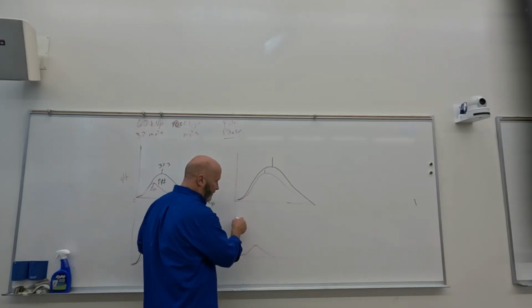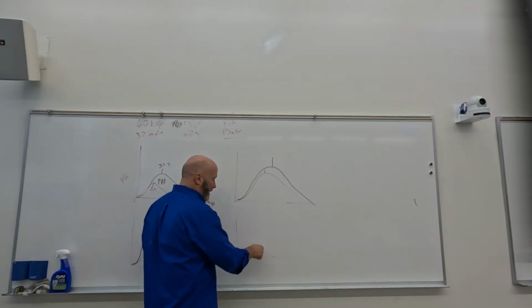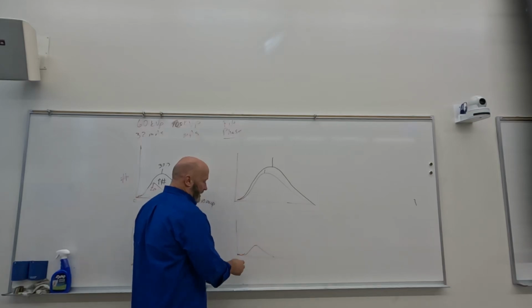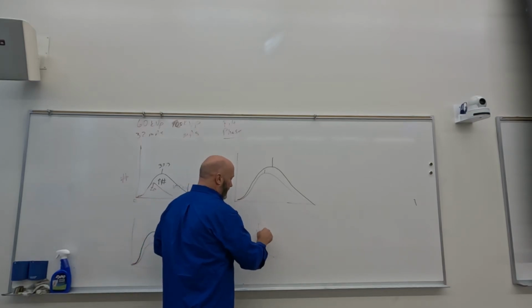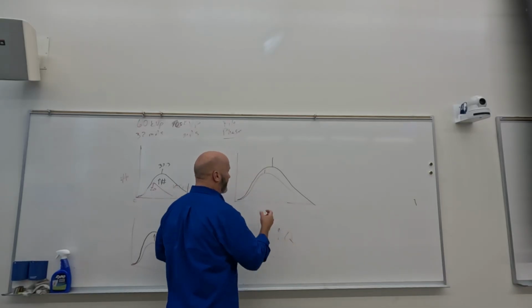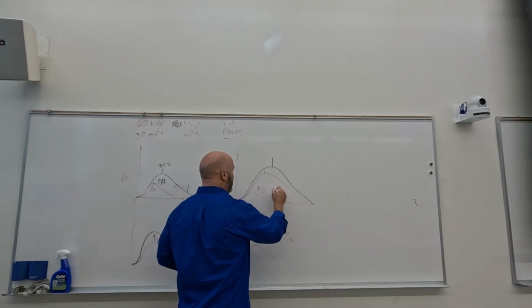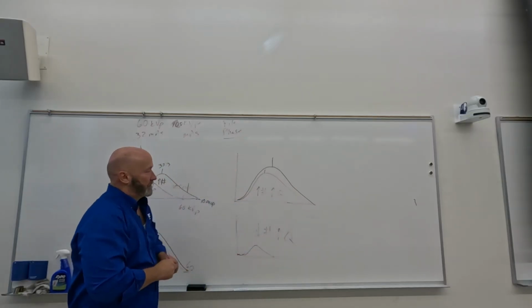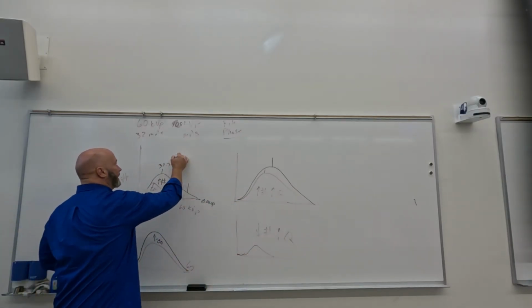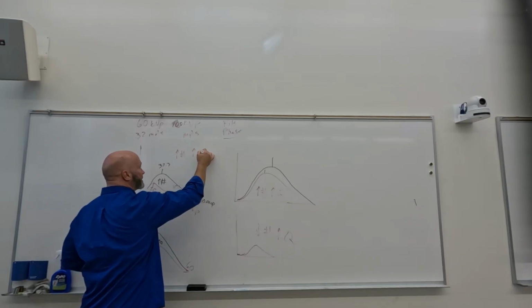If you were to average out from 0 all the way up to 100, your average is going to be quite low. But if you eliminate all those low energy X-ray photons, what you're left with is a higher average. So what we get then is a decrease in numbers, increase in quality. Okay, so what we got here was an increase in numbers, increase in quality. And over here we got a drastic exponential increase in numbers, and an increase in quality.